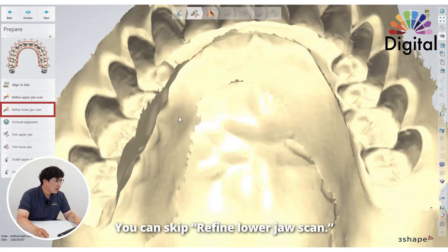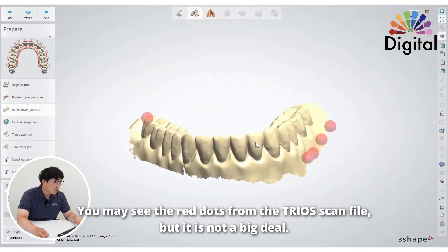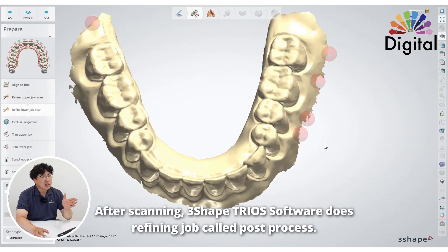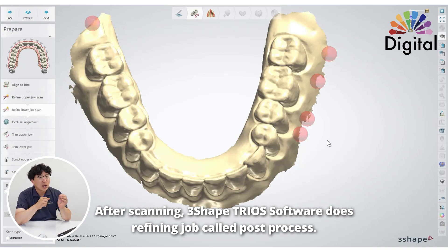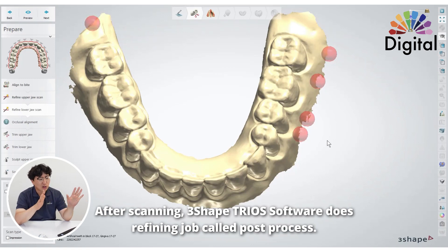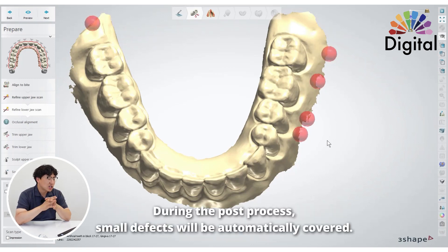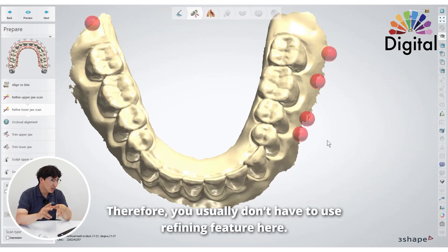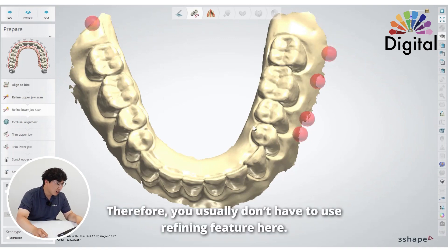For the lower jaw refine, we don't really need it. Usually from the TRIOS file you can see some red dots, but it's not a big deal. Also, TRIOS intraoral scan software — right after the scan is done, before sending to the lab — always does some refining work, what we call the post-processing stage. In that stage, small holes and artifacts are already gone. So usually we don't have to refine here.